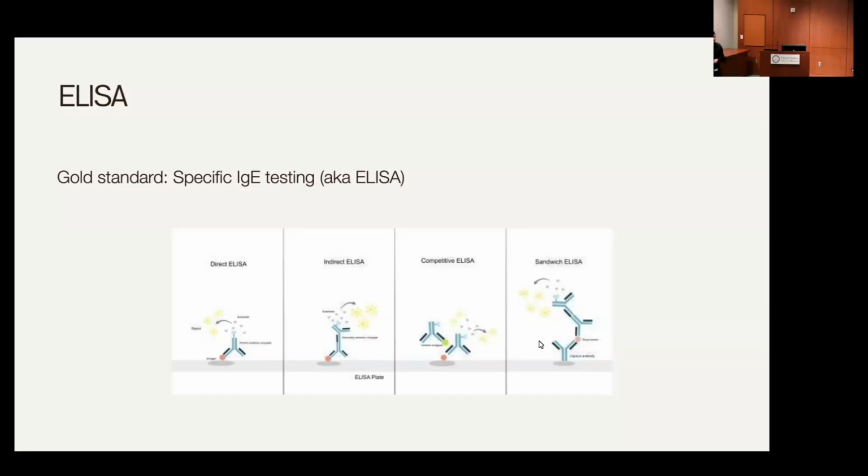We'll go ahead and wash, and finally we'll follow up with the enzyme-linked antibody, which is lab synthesized and has a high specificity for this antibody that goes after Borrelia. We'll wash again, and hopefully we have enzyme-linked antibody binding to the antibody that's used to fight Borrelia.